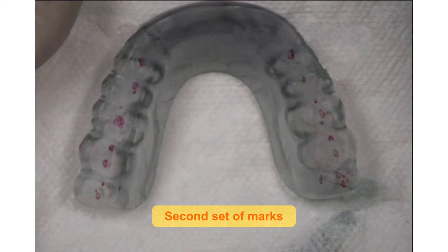If there is functional contact around the rim of the VHF, that too should be removed in order to extend the flat surface of the VHF. Contact on the rim can be an interference to centric relation, the same as anywhere else. The patient is again asked to close in back and grind hard in little bitty circles.